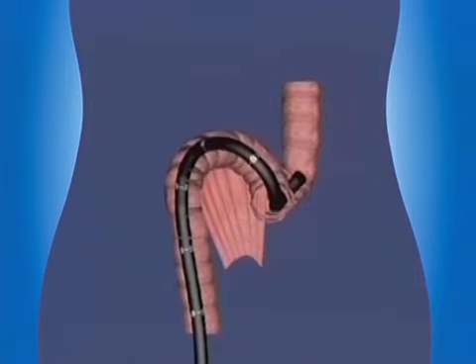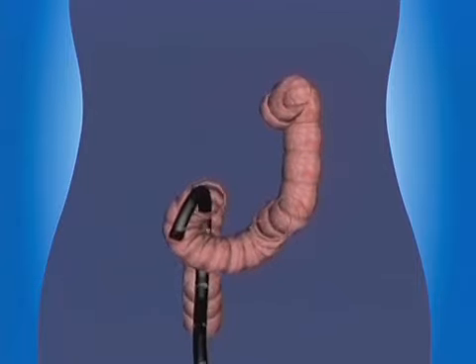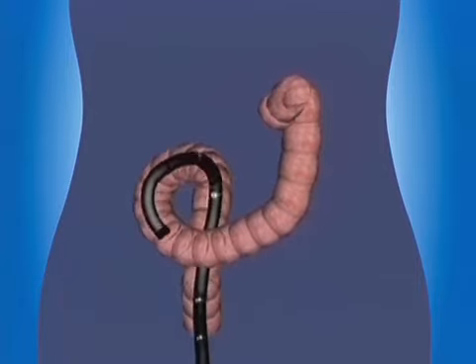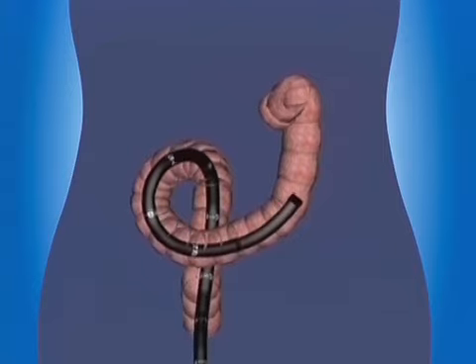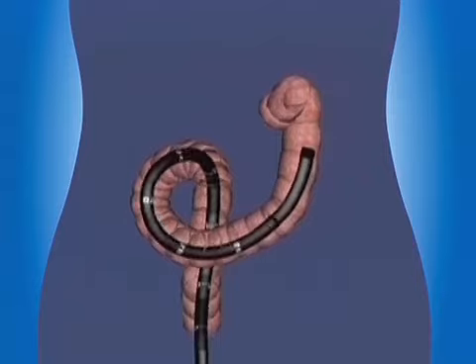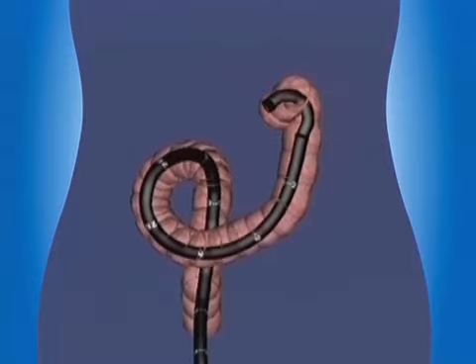These have been so-called N or spiral loops. But another loop, endoscopically very advantageous, is the alpha loop. The alpha is effectively a volvulus produced by the colonoscope when the sigmoid is fairly long and mobile, but the descending is retroperitoneal, so forming a fixed tunnel up the lateral wall of the abdominal cavity.